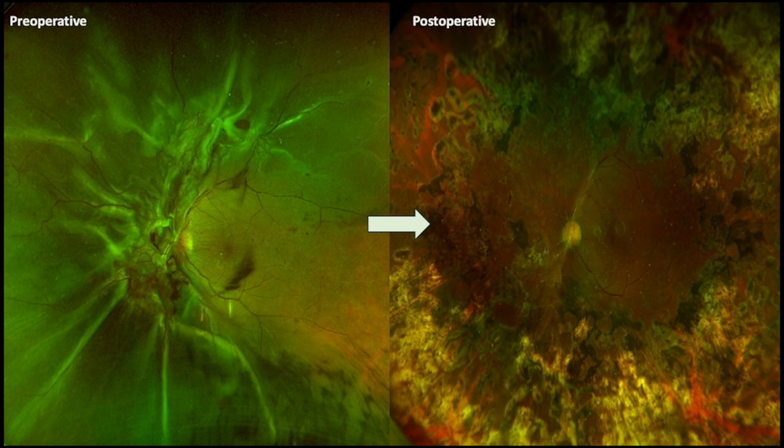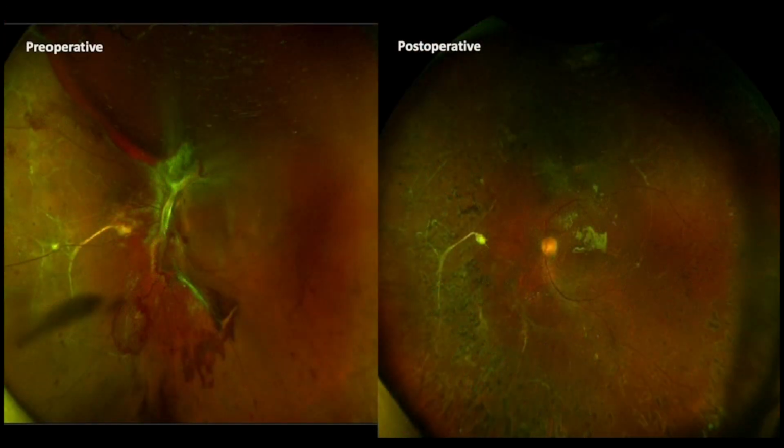The above case depicts a treatment-naive combined retinal detachment, at present with a good surgical outcome, emphasizing the importance of proper identification of dissecting planes.